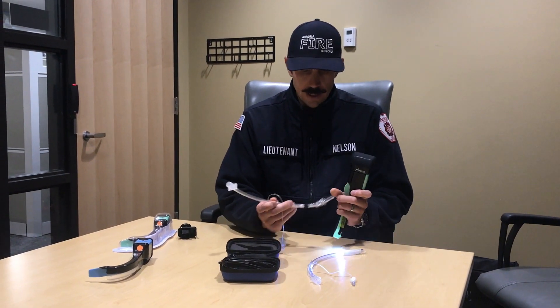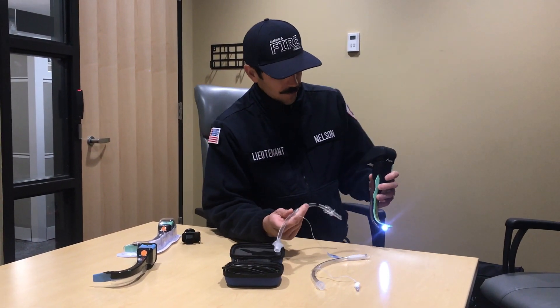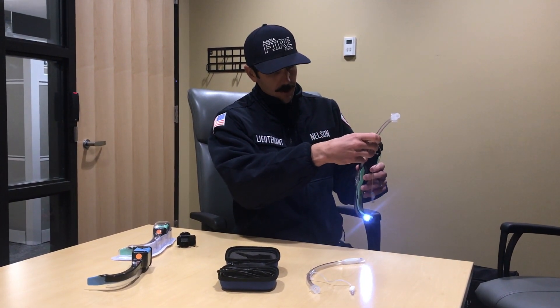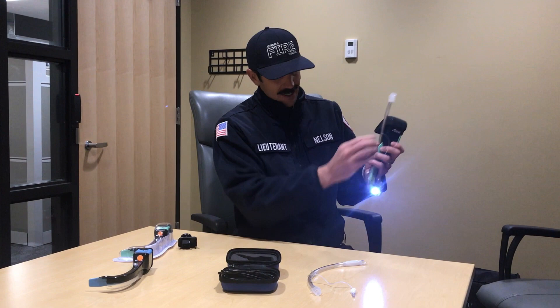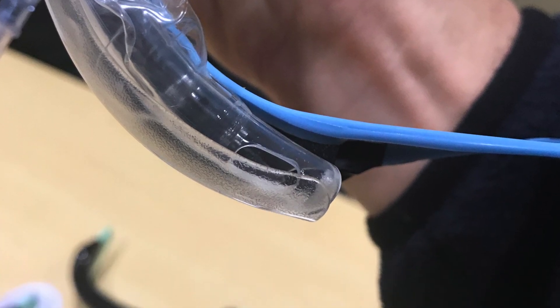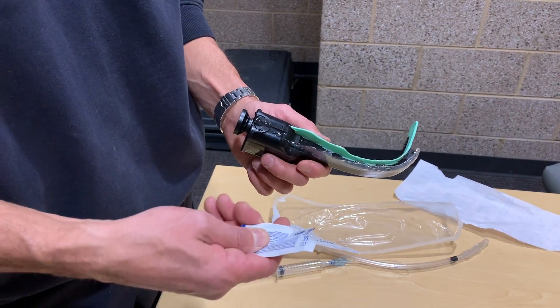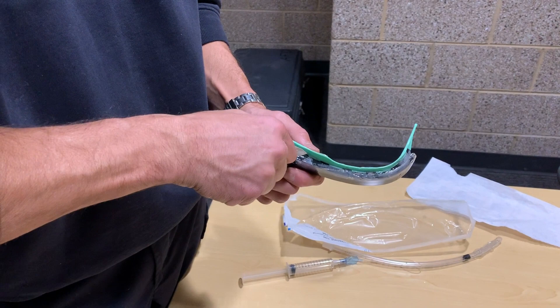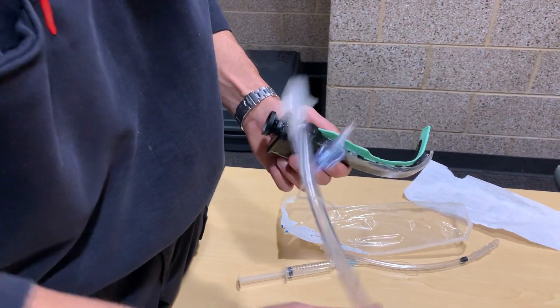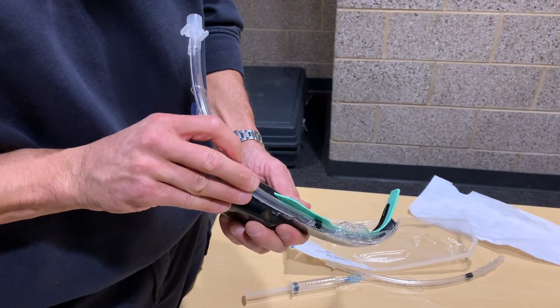Next step: take your tube. You're going to lube your tube up. Remove any stylet that's placed in the tube prior to putting it in the channel. You're then going to thread the tube through the channel until the tip of the tube meets the clear end of the channel. You can take your lubrication packet and squirt it into the channel, then run the tube through — and you're ready to go.